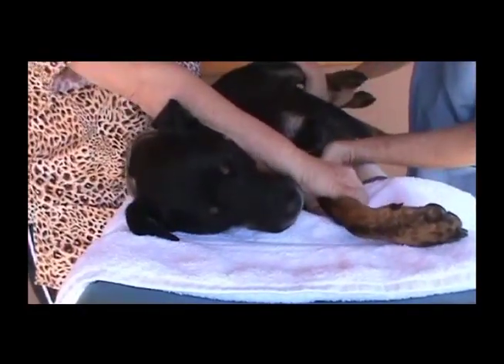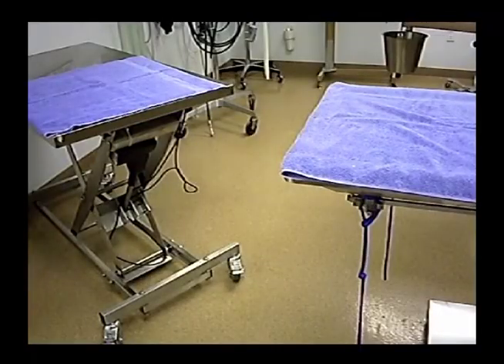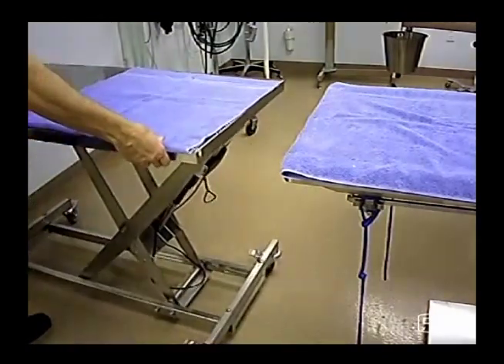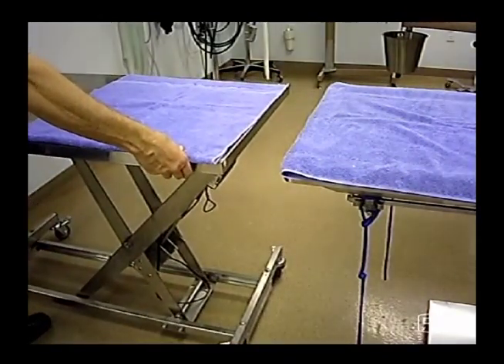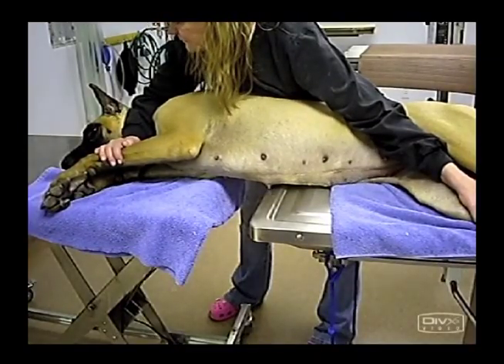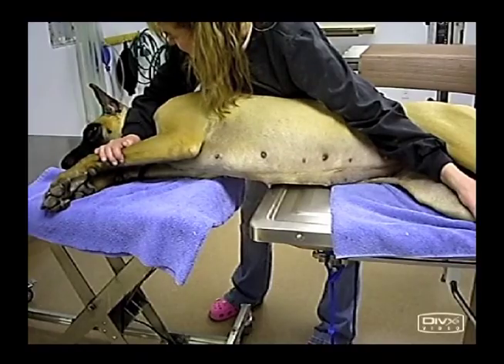If the patient is too large to fit on your cardiac table, you can use an exam table and a gurney placed end to end, leaving a gap between the two tables. The patient is placed in right lateral recumbency with the heart over the gap.